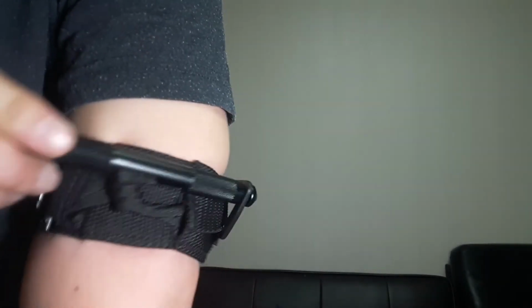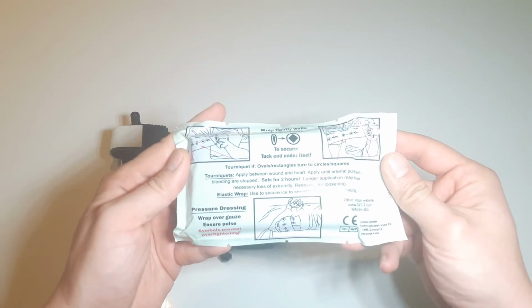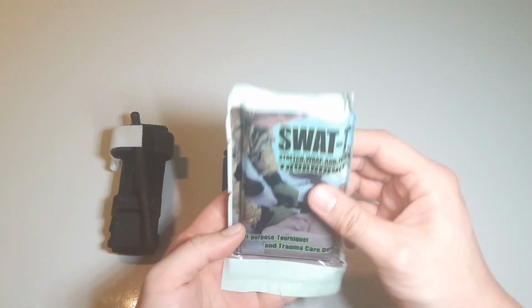The Swat-T tourniquet is the cheapest of the bunch at around $12. It's not the easiest one to use for self-application, but with practice it is doable. It's basically 4 inches by 4 feet of a latex-free band, and the instructions for use is right in its name: stretch, wrap, and tuck.